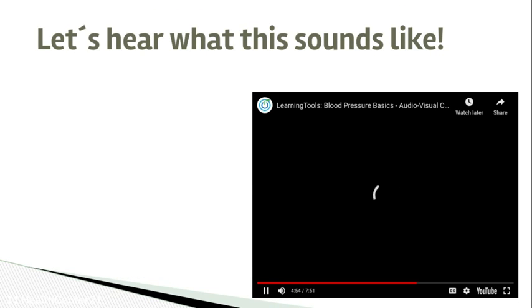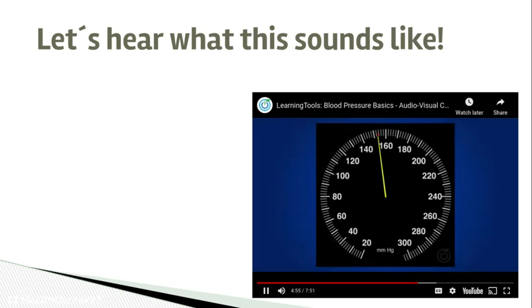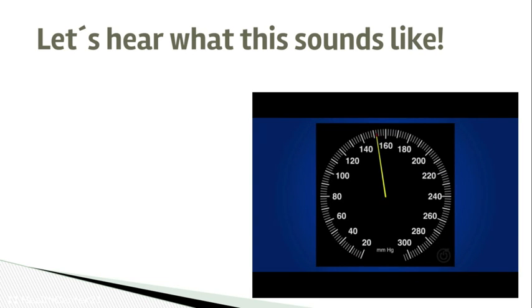So let's hear what this sounds like. See if you can follow along here. Use 114 over 76 as an example. The first time you hear the beat, notice what number it's at, and then when you lose it.